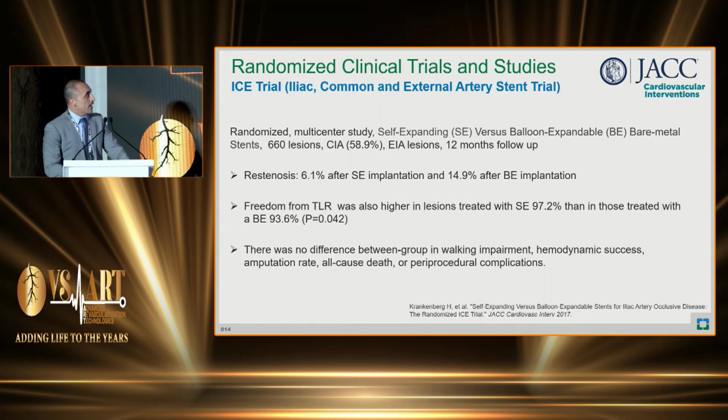The ICE trial looked at both self-expanding versus balloon-expanding bare metal stents, though, in this study, and showed the risk of restenosis much lower with the self-expanding stents compared to the balloon-expanding stents, and the freedom from TLR was higher in lesions with self-expanding stents. However, this was not translated clinically, as there was no difference between groups in walking impairment, hemodynamic success, amputation rate, all-cause death, or periprocedural complications.